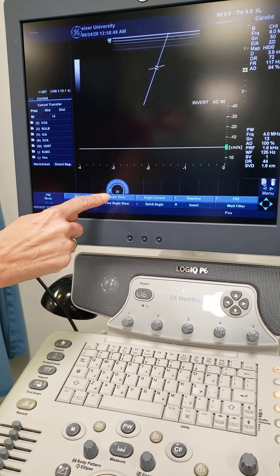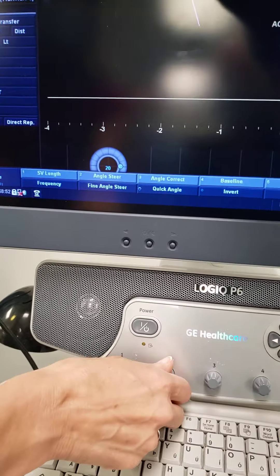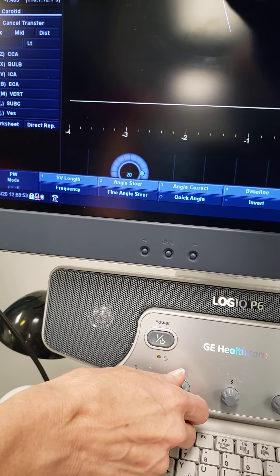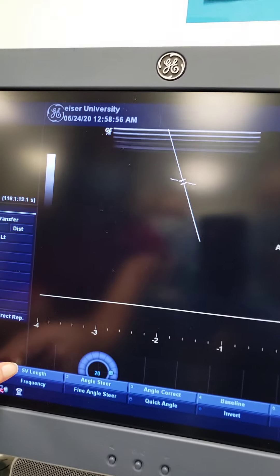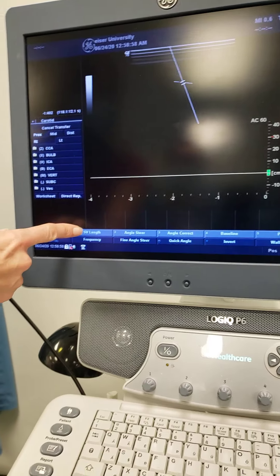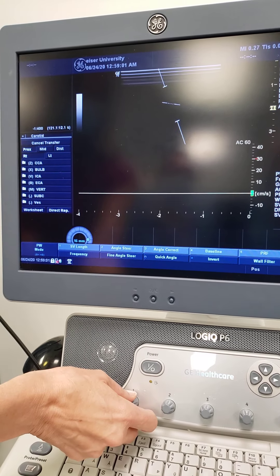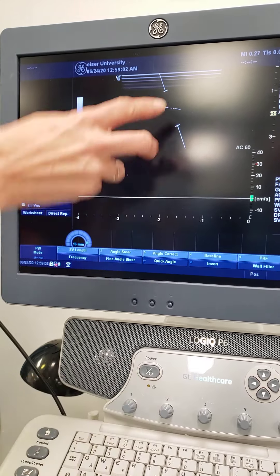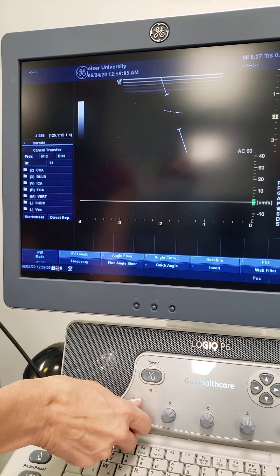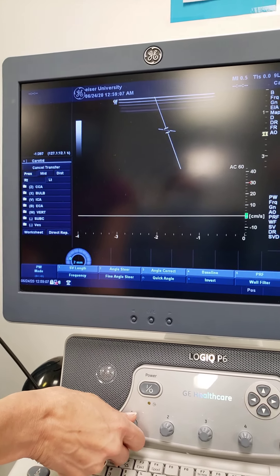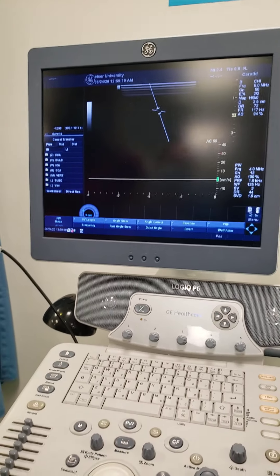Steer — see how it can steer? It says steer angle, so I'm steering the beam. And that's your gate? That's the gate. Now, you look for what's called sample volume on this machine, but some machines might actually call it gate. That allows us to be more selective. We can sample a whole large area, a small area, or something in between. So that's the gate.